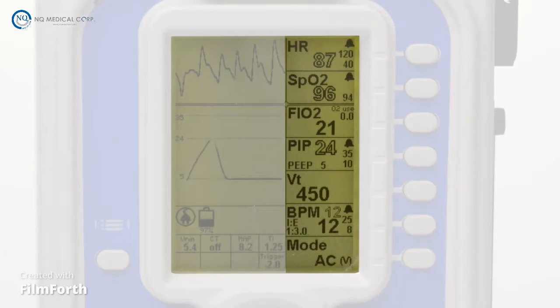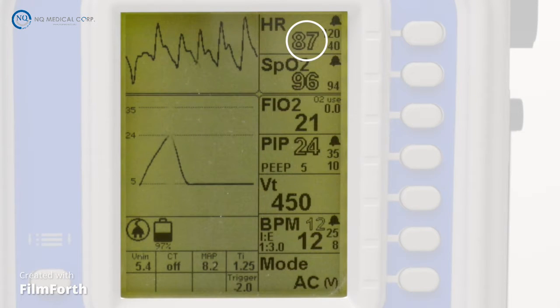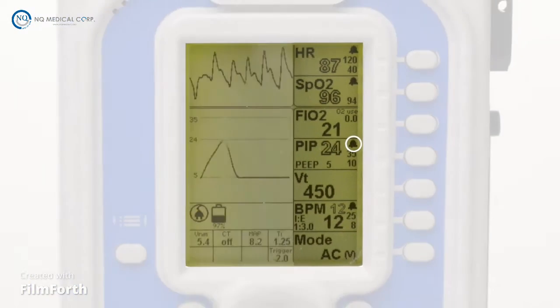Within each window, outlined text corresponds to monitoring readouts or calculated values that pertain to the specific parameter, such as heart rate or SpO2 level. Outlined text values cannot be changed. Solid text represents the current parameter settings. These can be adjusted. The bell icon indicates that an alarm is set to alert the user should a monitored parameter fall outside of the desired setting ranges.